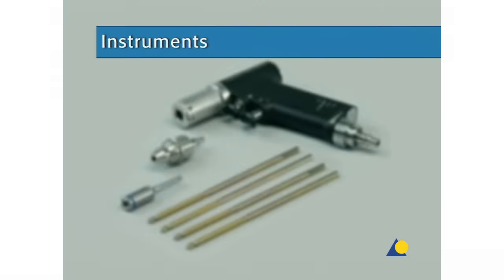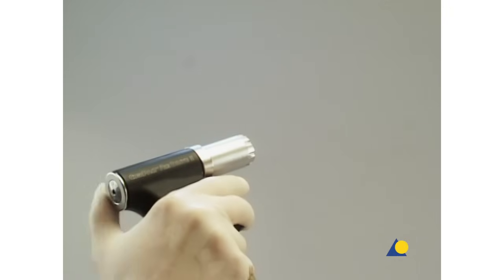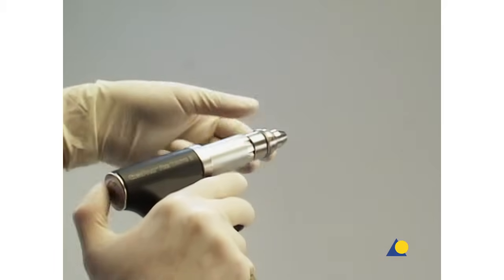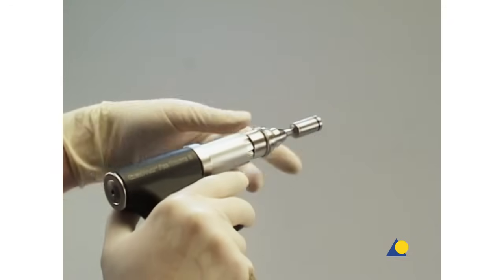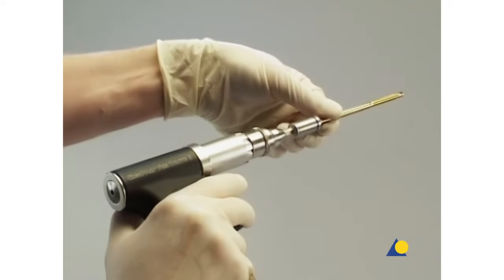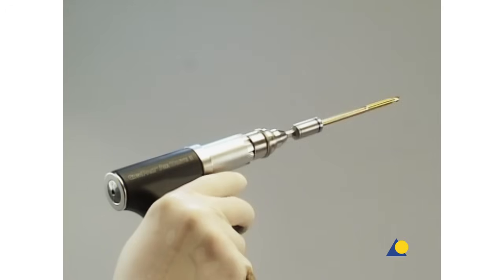The instruments needed are the compact air drive, the quick coupling, and the drive adapter with quick coupling for 5-millimeter Schantz screws, and four 175-millimeter long, 5-millimeter diameter Schantz screws with a thread length of 60 millimeters. Conventional Schantz screws may be used as well.